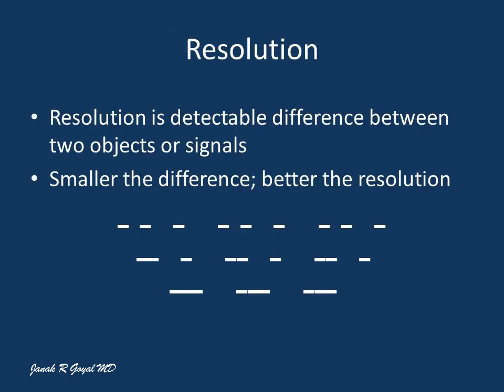Let's look into one of the most important issues which we always talk about, which is resolution. So what is resolution? Resolution is the distance between two signals or objects which your equipment, in this situation the ultrasound machine, could detect. The smaller the difference, the better the resolution.